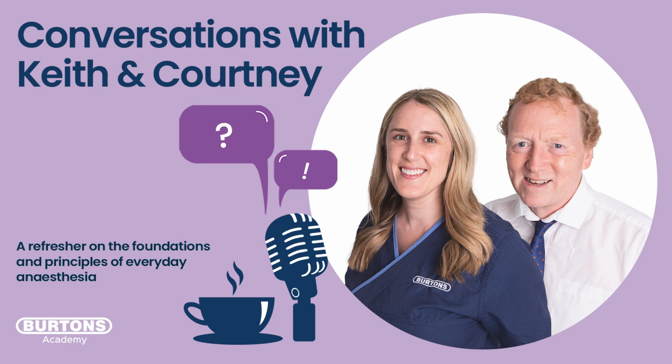Thankfully, in my anesthesia experience, I found that most of the patients I've wanted to ventilate were not breathing much in the first place. So I felt quite lucky. They've got a really low respiratory rate and they're not taking big volumes of breath. And I start to ventilate them and their CO2 flies up, and I'm thinking, oh gosh, even though it was like 55 or 60 millimeters of mercury, you still weren't taking a breath, probably because you're a little bit too deep or something like that.